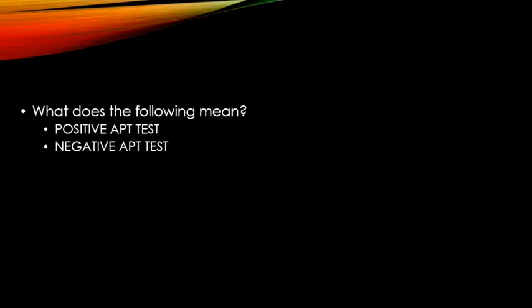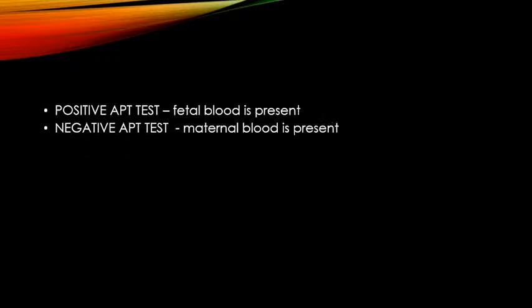Okay? Now, what does a positive APT test result mean? A positive APT test means that there is fetal blood present. A negative APT test means there's mother's blood present. So usually this is done bedside. But why do we need to know about this? This is because some laboratories have POCT, point of care testing.